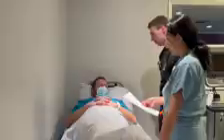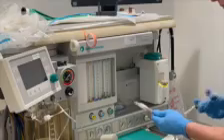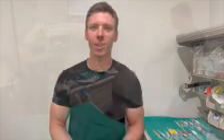Before we begin, I want to say a few words about what we are trying to accomplish with this video. As you will all quickly realize in the clinical setting, anesthesia is a specialty where similar results can be achieved through different approaches. And as a result, you will see a wide range in preferences, methods, and overall style among anesthesia providers. What we are doing here is providing a thorough, evidence-backed method of general anesthesia induction that you can all reference as you practice in the simulation lab and get ready for the first day in the operating room. With all of that being said, let's get started.